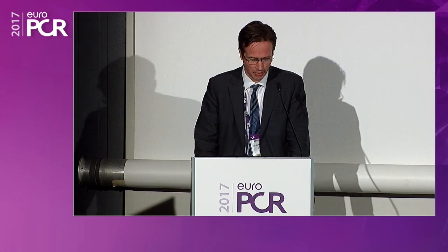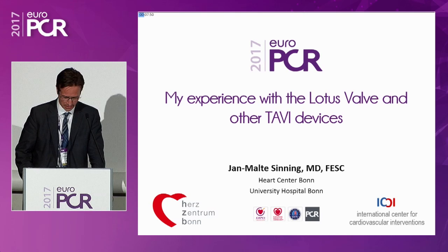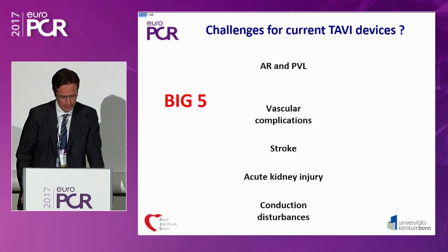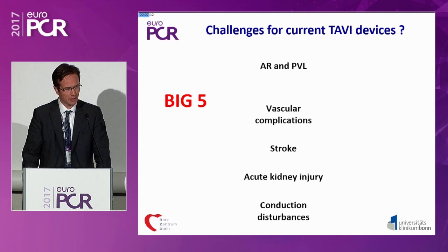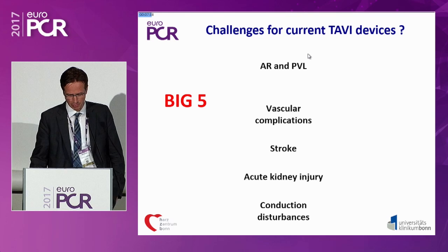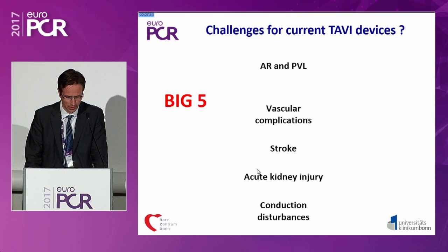Ladies and gentlemen, dear Chairman, it's my pleasure to share with you my experiences with the LOTUS Valve and other TAVI devices from our clinical practice. These are my conflicts. And first of all, let's ask what are the remaining challenges for the current TAVI devices we are using in our practice. And there is a big 5 consisting of paravalvular leakage, vascular complications, stroke, acute kidney injury, and conduction disturbances.